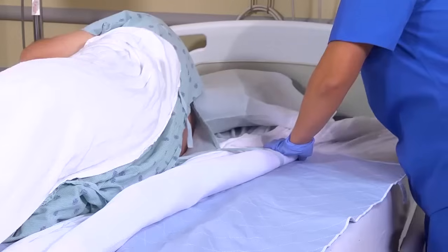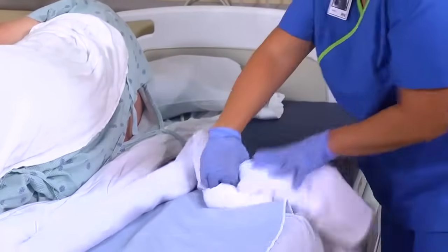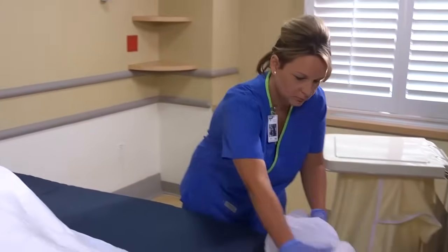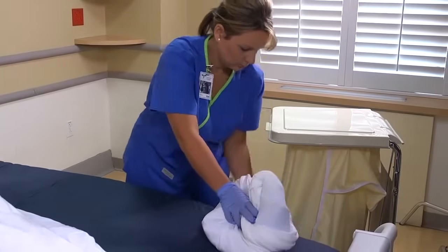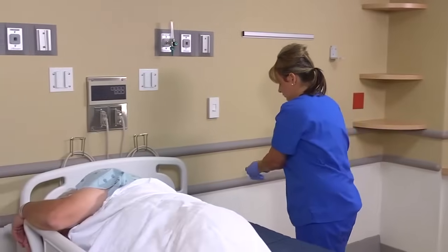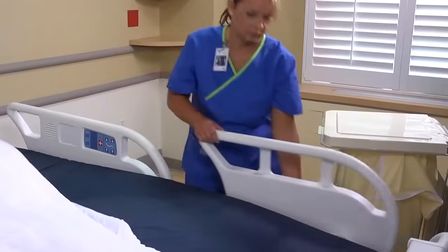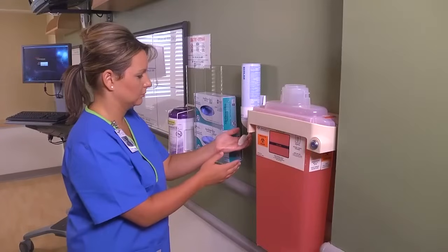Loosen the edges of the soiled linen from beneath the mattress and remove it by folding it into a bundle or square, holding it away from you as you place it in the linen bag. Then clean, disinfect, and dry the other half of the mattress if necessary. Remove and dispose of your gloves. Raise the side rails and perform hand hygiene.